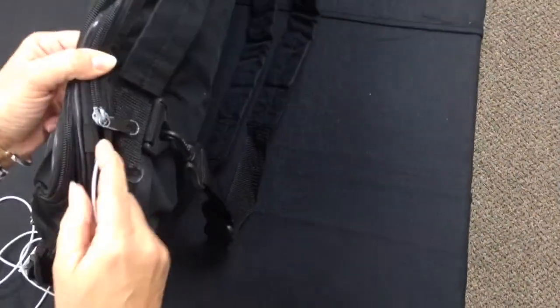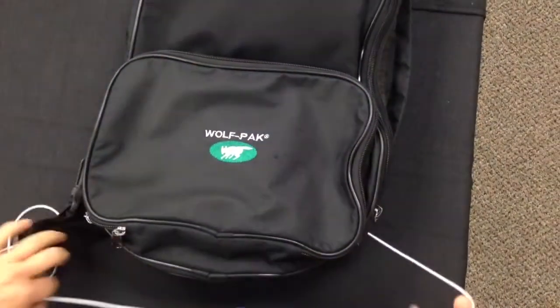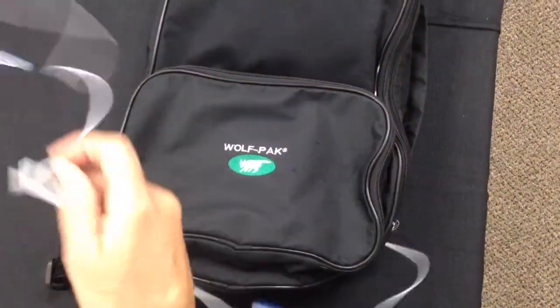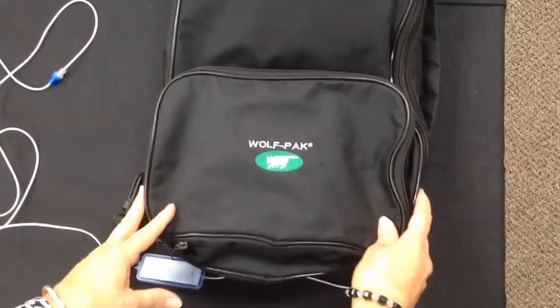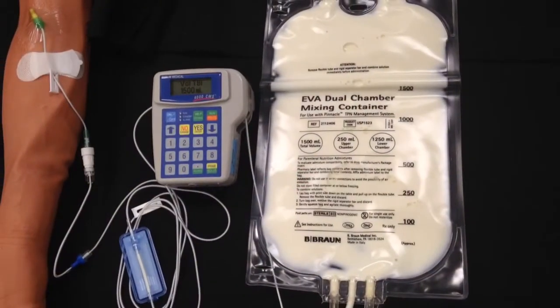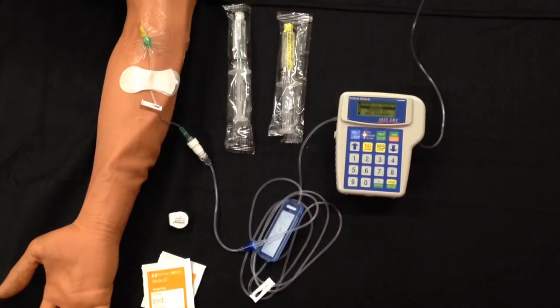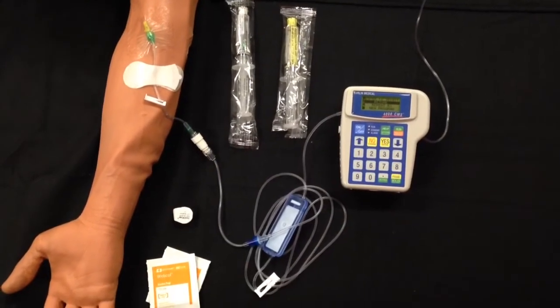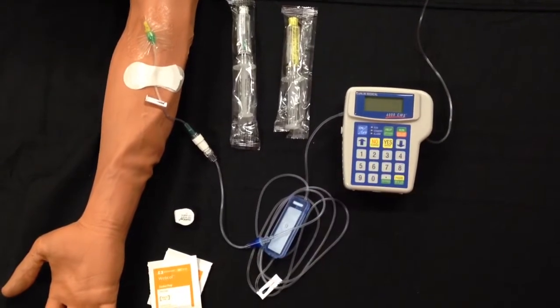Don't worry about crimping the tubing. There's a special little place for the tubing to come out. Make sure you have all of your tubing so you have plenty of line. And now you're ready to be mobile wherever you're going. Your TPN will run over 12 to 24 hours depending on your prescription. When your TPN bag is finished, your pump will stop. Turn your pump off.